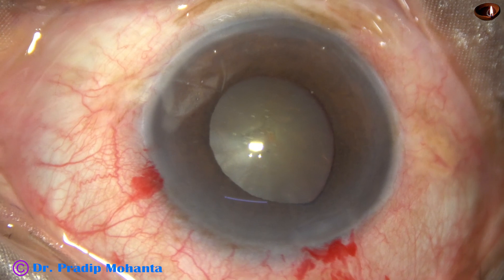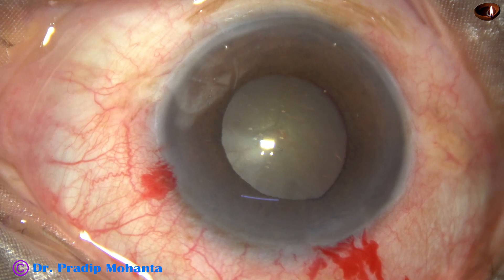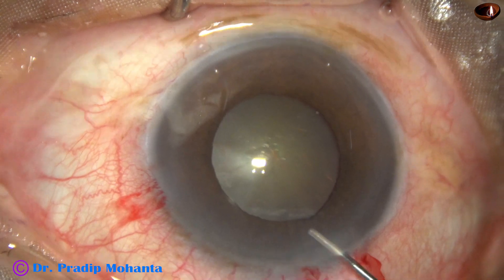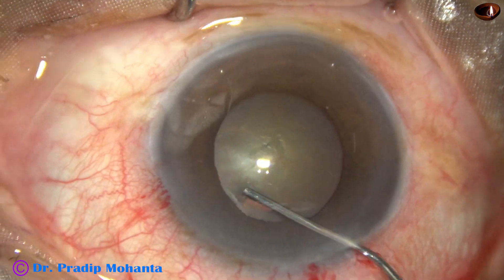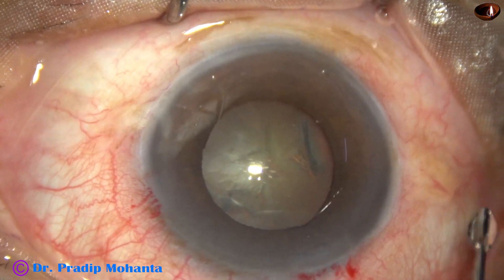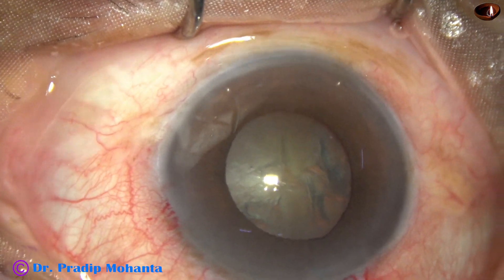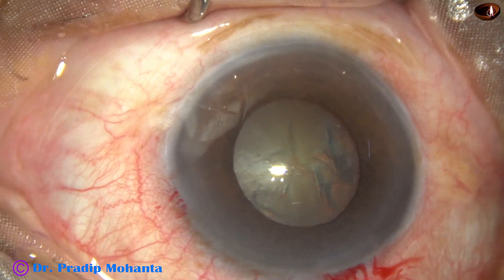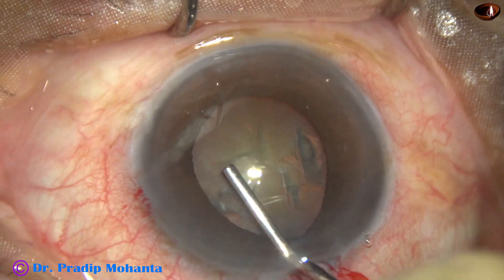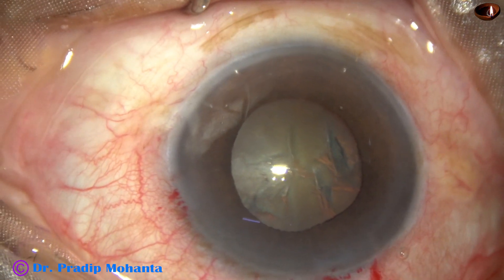The iris tends to prolapse through the main wound. The patient is 85 years old with BPH, benign prostatic hyperplasia. The patient has been on Tamsulosin for 2 years and has several other comorbidities. Viscoelastic substance is injected judiciously — if we inject too much visco, the iris will prolapse through the main wound.